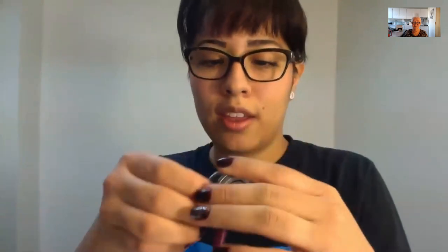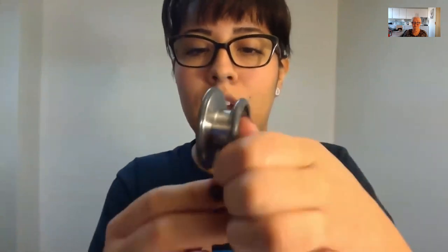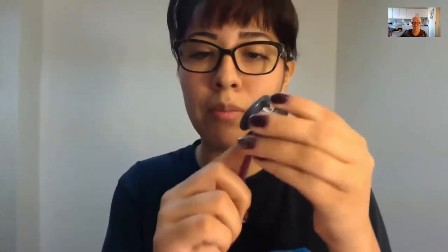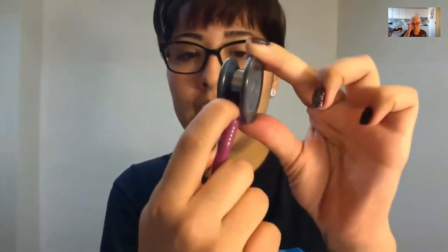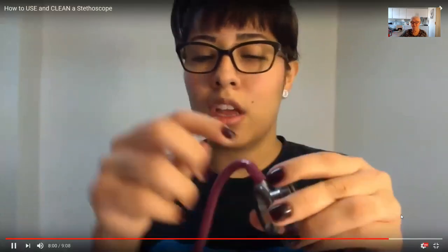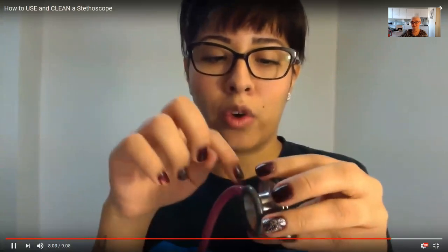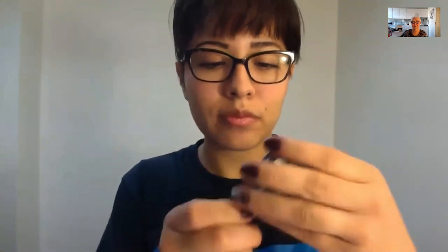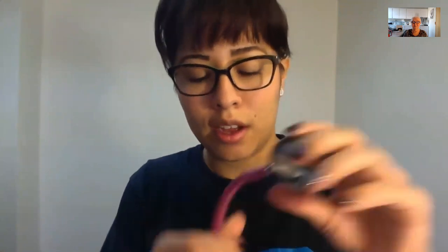And when it comes to cleaning in between this area here, it gets a little bit hard because, I don't know, you might have small fingers, but my fingers are pretty big. They do fit, but it's hard to get, especially in this area down here. What I use is I'll put the Clorox wipe down and grab a pencil or a Q-tip, whatever is small enough to guide the Clorox wipe in there to clean it off. I think that's the only piece.